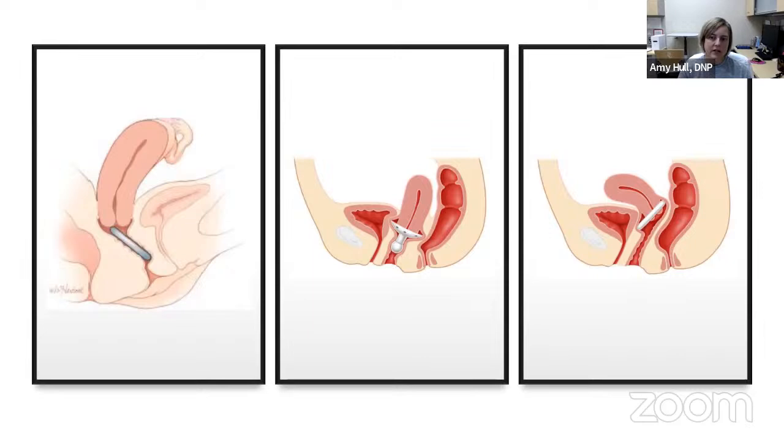And then that one on the right there, you can see the tip of the cervix. And so I'm assuming it's probably a ring without support, which we'll use a lot of times in our pregnant patients who have prolapse and need something to help elevate that uterus, at least until they get further along in their pregnancy, when the uterus comes up and out of that pelvic rim. We'll use those kinds of pessaries, rings without support, so that they can still have the cervix not be irritated potentially by that pessary, but long enough until they can get further down the second, third trimester and get that uterus up and out of the pelvis.